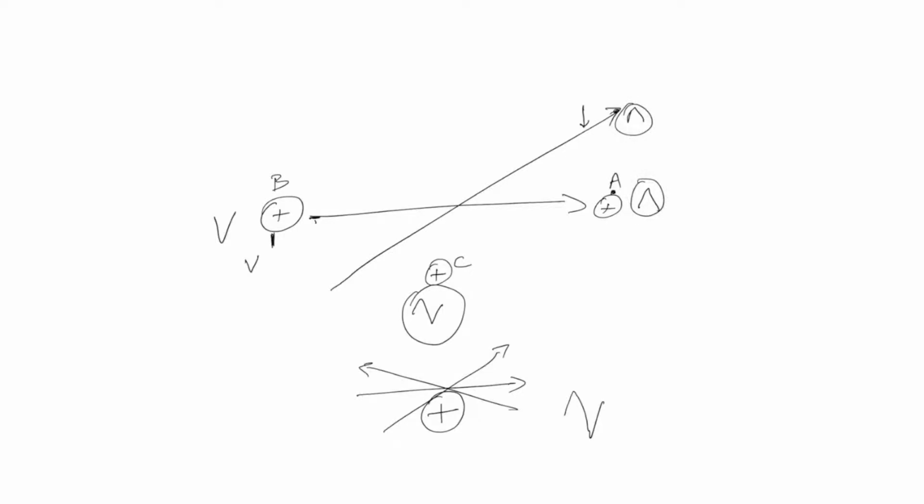Now let's take this a step further. What if you have two leads? So you have a negative lead and a positive lead. And essentially, the two leads are going to give you a measurement that's going to help you extrapolate the flow of depolarization from the negative to the positive lead. So let's consider the first scenario. You have a flow of current that's going like so. If that's the flow of current, you would pretty much just see a positive deflection. How about if the flow were like so?